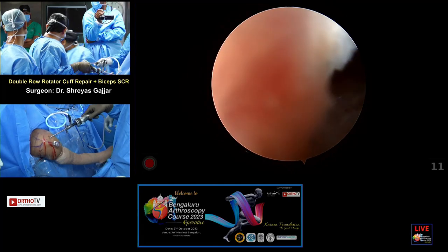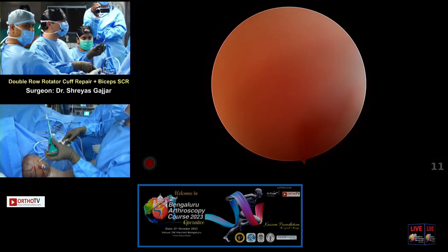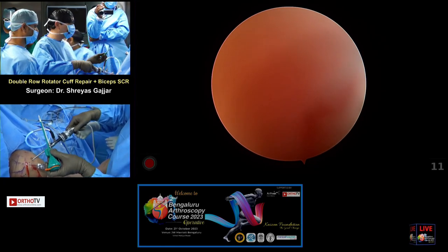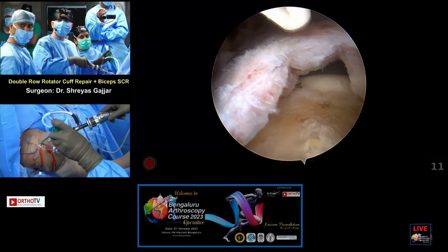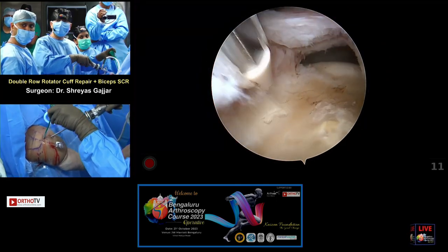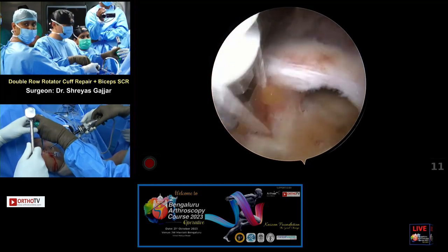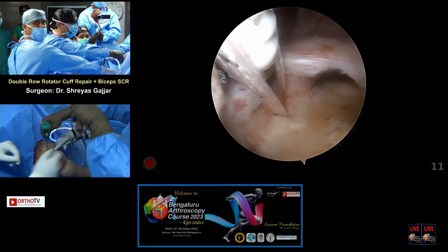If you have the outside image, this is a preloaded swivel lock which comes in the kit. It's four anchors, two have the tapes which are preloaded and the ends are merged. For a tail like this, which is not retracted, you can pass it through a single passage. So I'll do that. Give me the hammer. So we have inserted it.